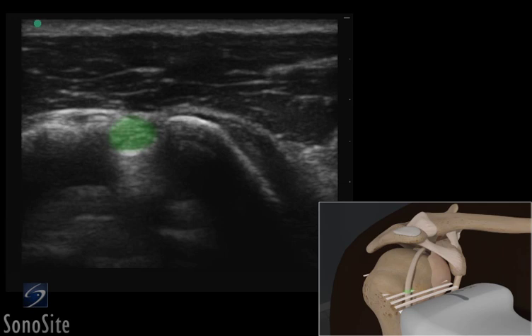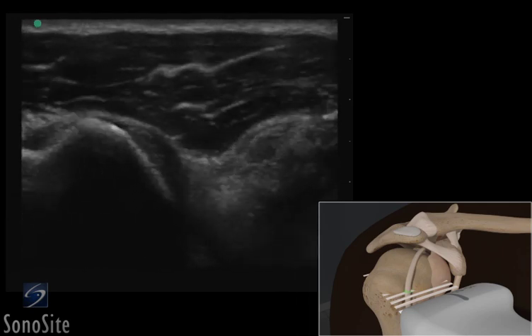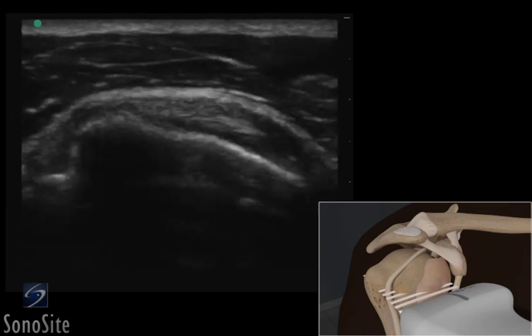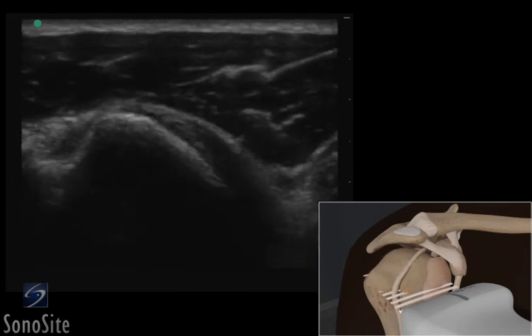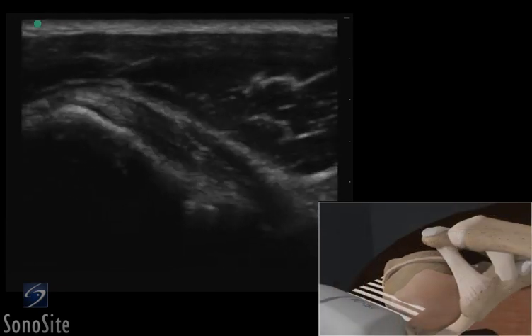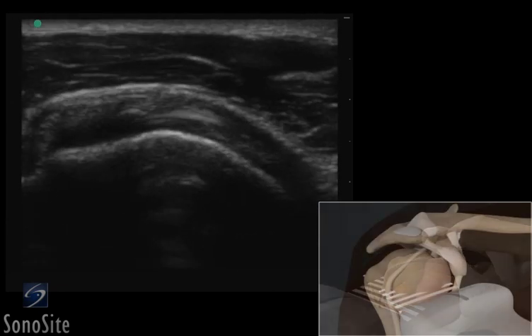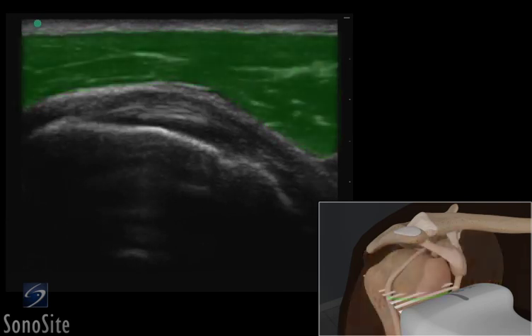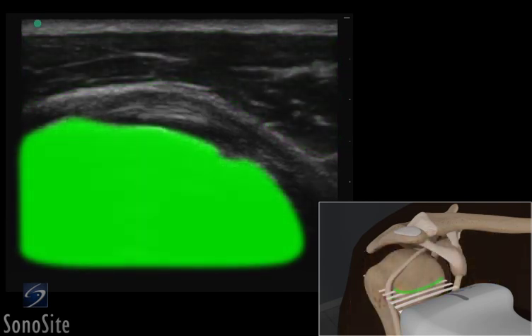The arm is then externally rotated to bring the bird's beak-shaped subscapularis tendon into view as it inserts into the lesser tuberosity. The subscapularis tendon lies between the superficial deltoid muscle and the intense, bright hyperechoic reflection of the humerus below.